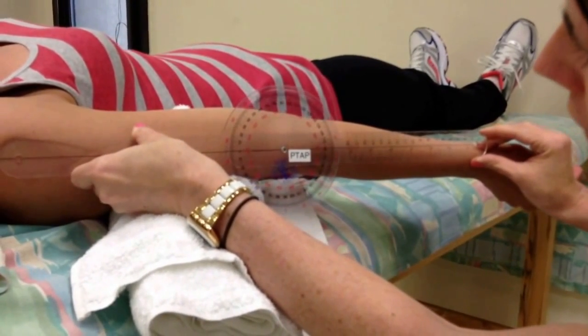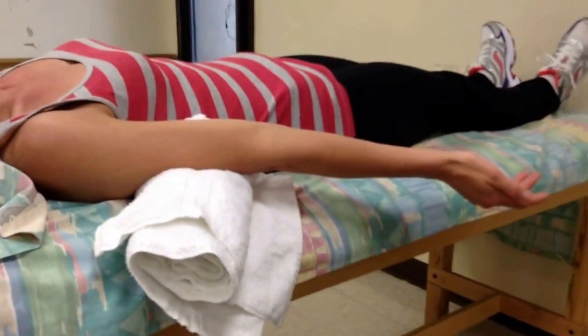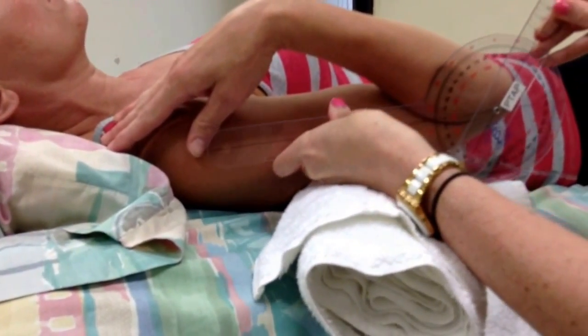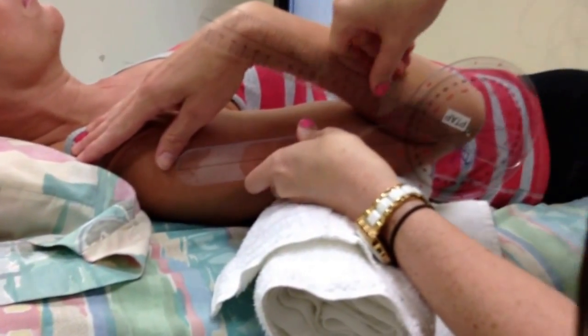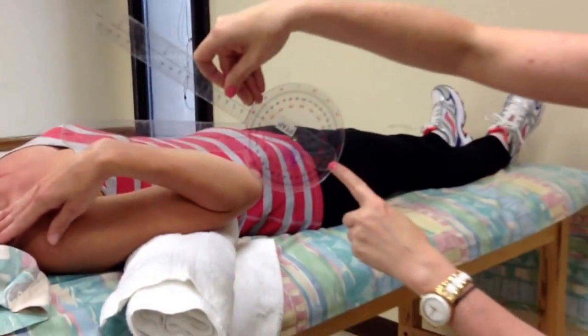Suzanne has 0 degrees of extension. And then for flexion — Suzanne, can you bend your elbow up as far as you can? Everything is the same: the lateral epicondyle is where I put my fulcrum, the acromion process is where the stationary arm goes, and the radial styloid process is the moving arm. Suzanne has 152 degrees of elbow flexion.